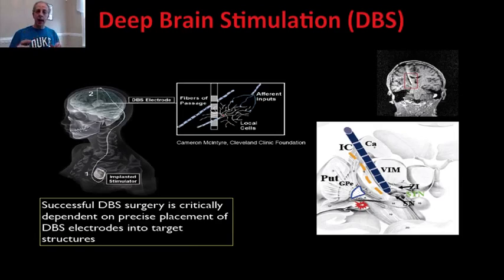The basic idea is that, as we see in this image, an electrode is inserted in the brain and pulses are sent. So the electrode is inserted and there's also a generator that is normally put in the chest with a battery, and that generator sends electric pulses and basically stimulates a given region in the brain.